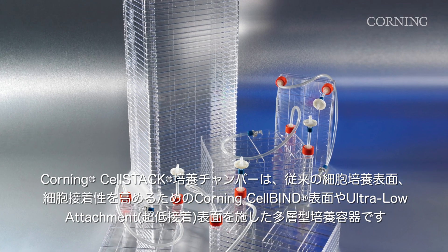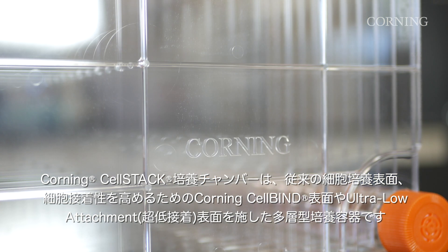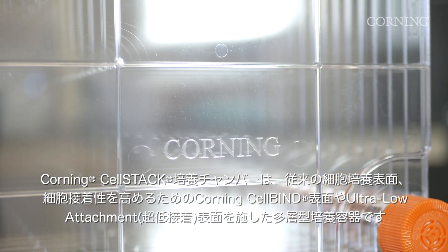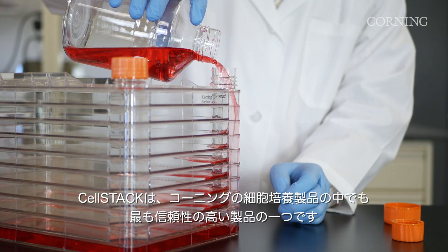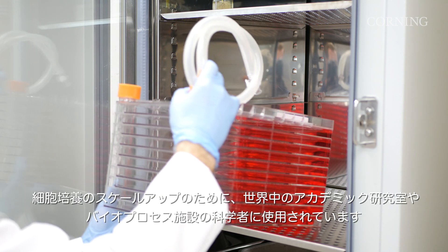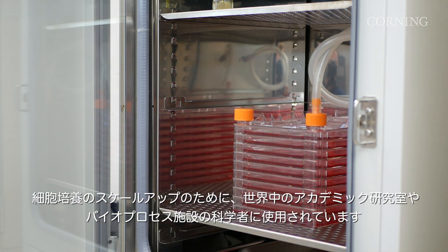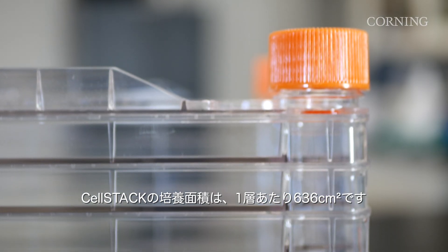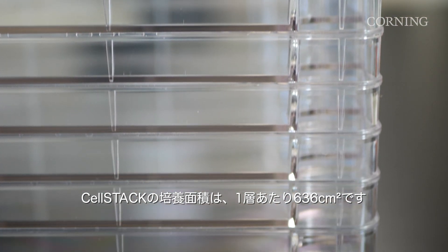The Corning Cell Stack is a stacked unit culture vessel available with traditional surface treatments such as Corning Cell Bind surface for enhanced cell attachment and ultra-low attachment surface treatment. The Cell Stack is one of Corning's most reliable cell culture products, used across the world by scientists in academic labs and bioprocessing facilities alike for scaling up cells. The Cell Stack offers 636 cm² of cell growth area per layer.